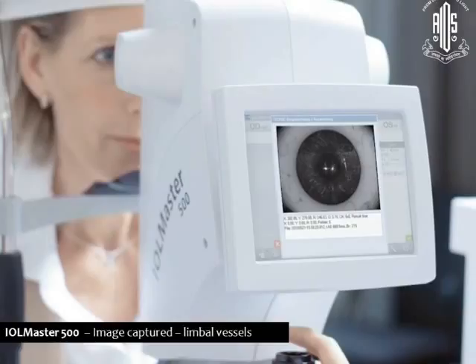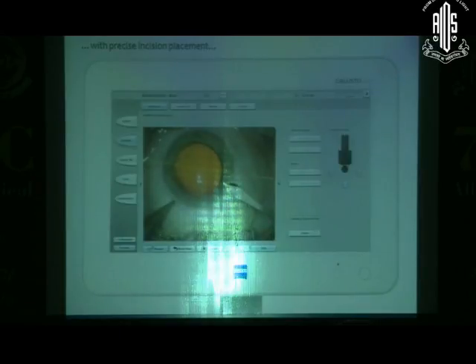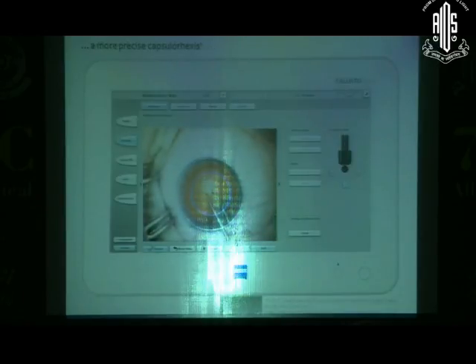And later on, you upload it to this Forum workstation, which is just a management software program, and that can communicate with the operating microscope through this machine called Callisto, which is basically a computer and the software. Whether you transfer it by a thumb drive or over the internet, you basically, as Dr. Titia showed, match up the limbal vessels, and now we can actually see the 180-degree axis.